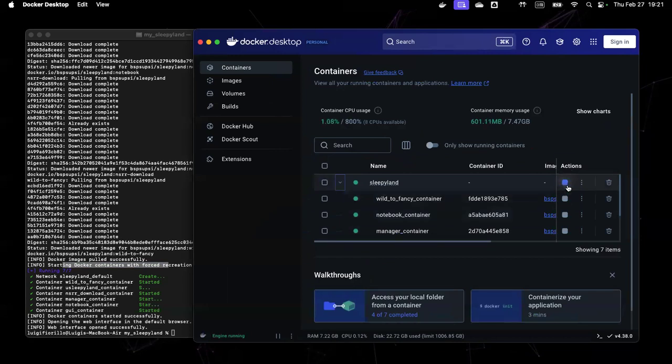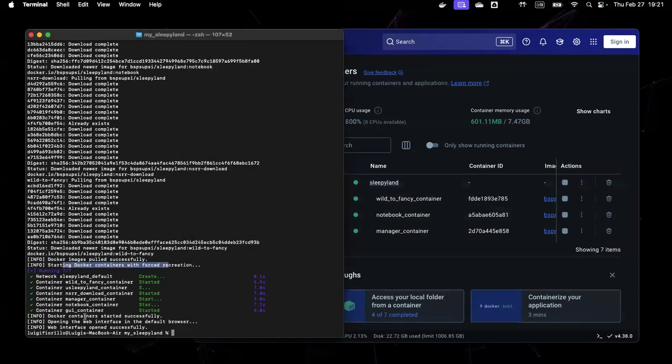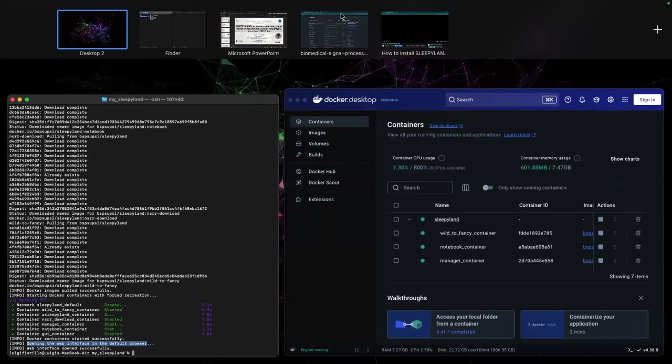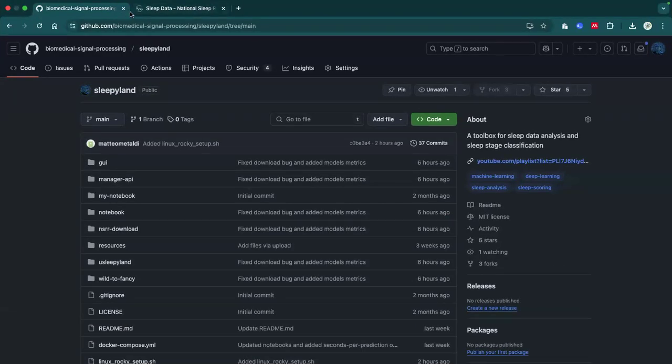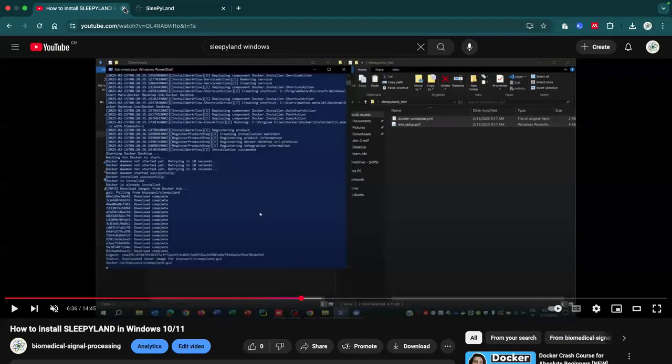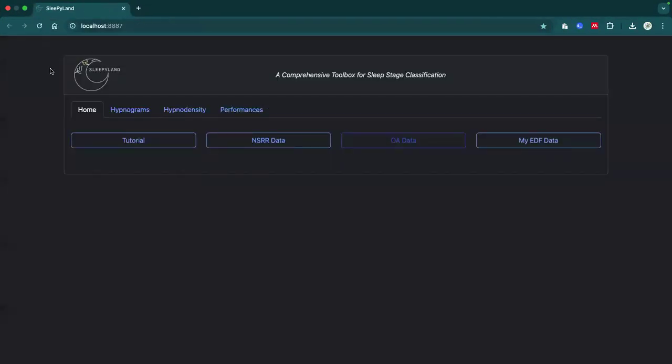If you see that, you see it's actually running, so I'm not going to stop it. In that case, it's running on my machine. It is going to directly open the web interface in your default browser. For that reason, whilst I was showing you the video before, we had this UI opened. And you should have this UI open on your localhost, on this port.